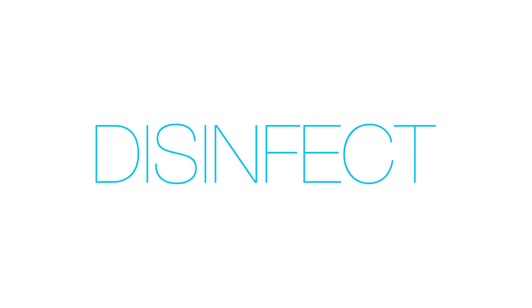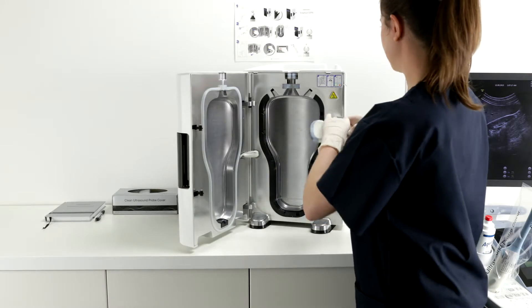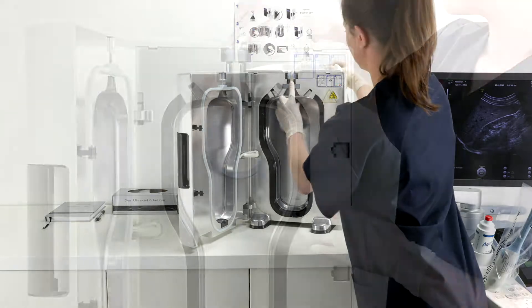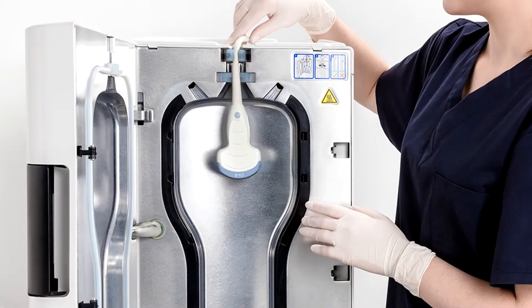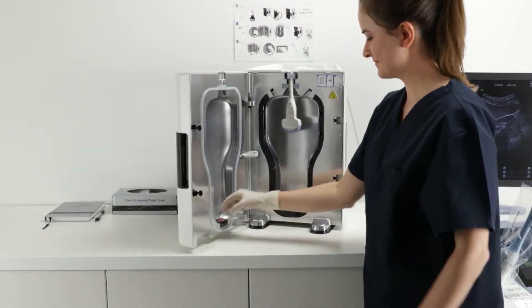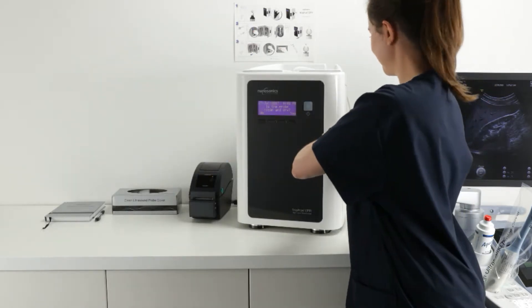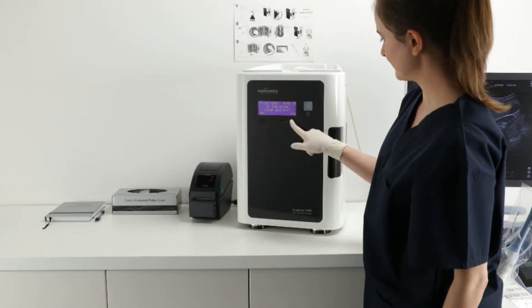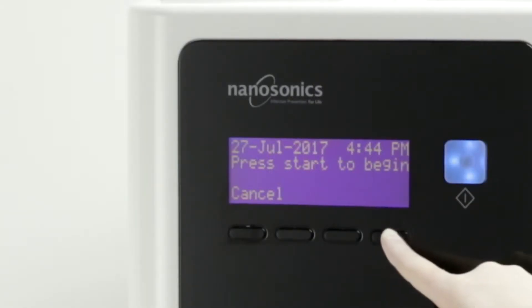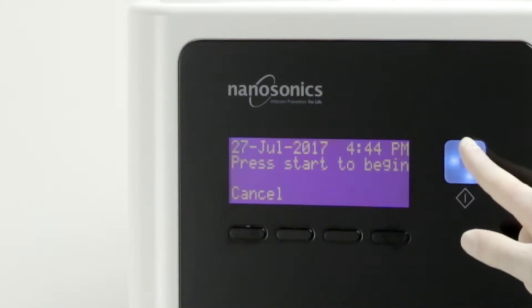Disinfect. Now that your probe is clean and dry, it is time to load the probe into TROPHON. Place the probe high in the disinfection chamber with the cable strain relief secured in place by the cable clamp. Ensure the probe does not contact the chamber wall at any point, with the tip of the probe above the embossed line. Next, place a chemical indicator into the locator at the base of the chamber door, red side up. Close the chamber door. Verify that the probe is both clean and dry by selecting Yes, shown on the TROPHON screen.